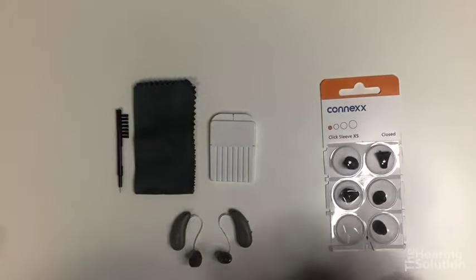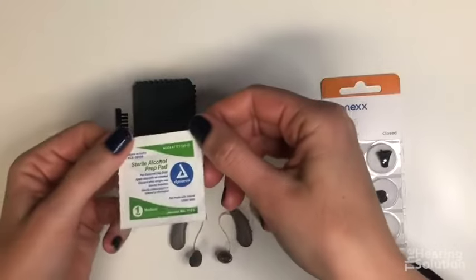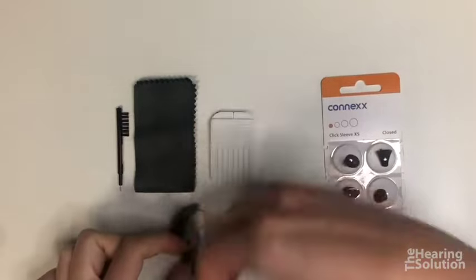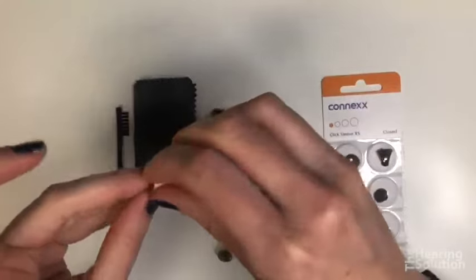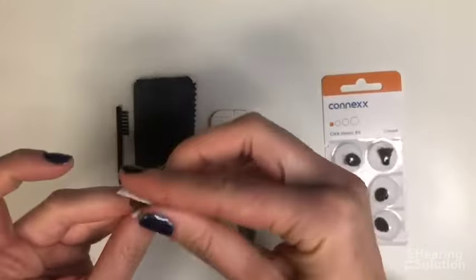How to clean your Signia hearing aids. The first step, you can take an alcohol prep pad and you can just wipe down the dome or the part that goes in your ear. And you can do this daily, if not weekly.